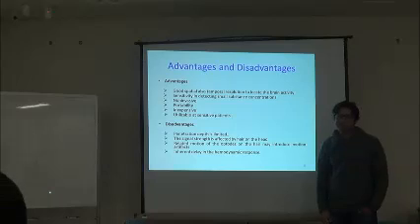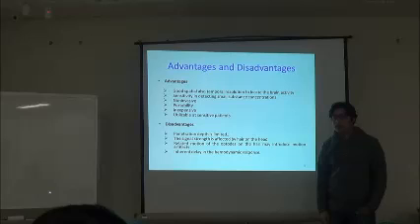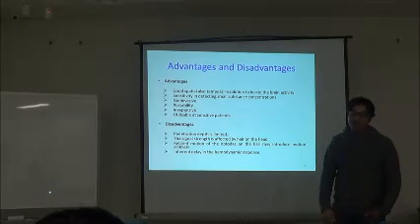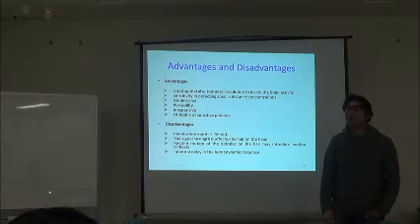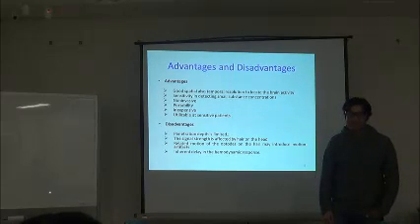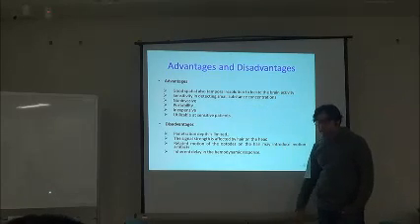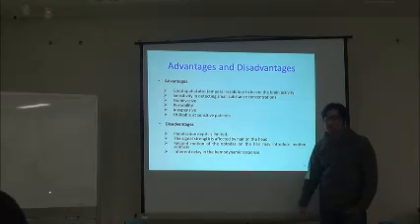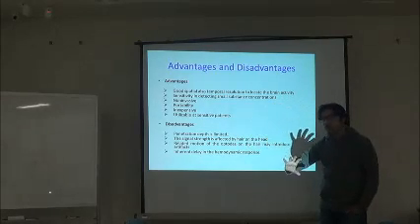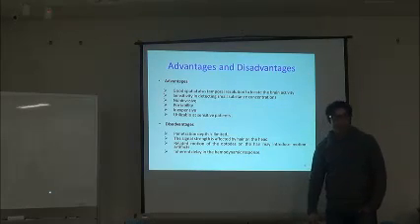So you mean we can remove the artifacts due to hairs mathematically? Yes, usually what we do is we avoid the hairs in the path of our optodes. If we cannot do that, it's a problem. We can remove the noises mathematically. There are some ways to remove those noises, and in the second part of my lecture, I will explain those: what kind of noises there are, and what removal techniques we use. Okay, thank you.